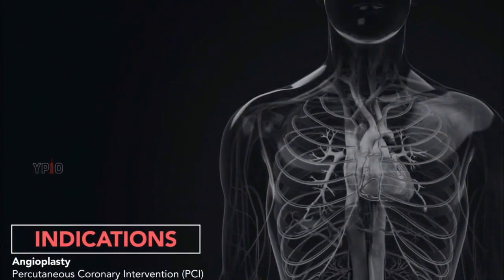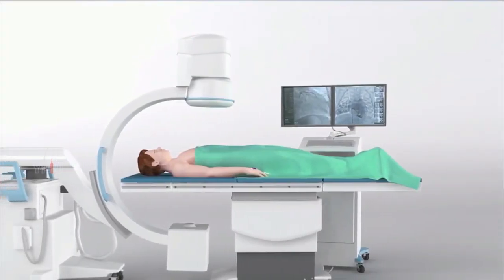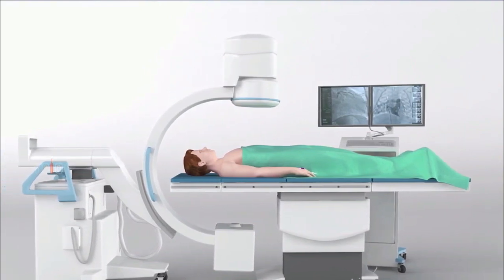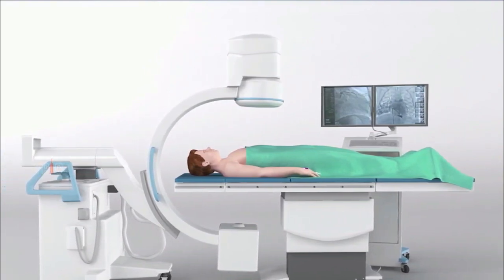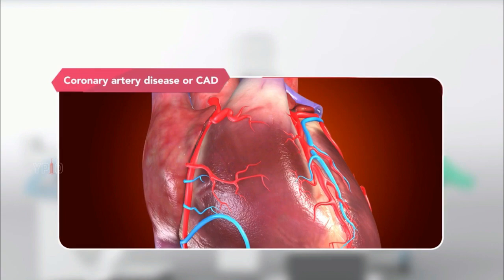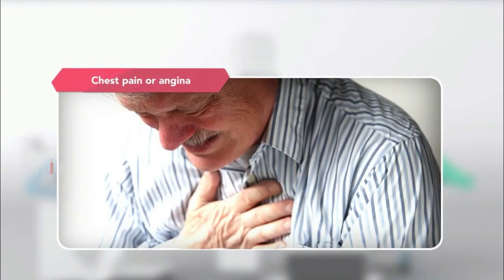Indications. Angioplasty or percutaneous coronary intervention is recommended for opening up and expanding the narrowed or blocked coronary arteries in your heart. Suitable candidates are people with heart diseases such as coronary artery disease or CAD, atherosclerosis, chest pain or angina.